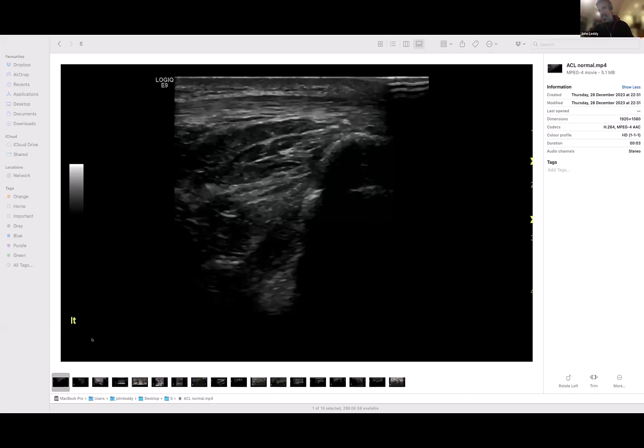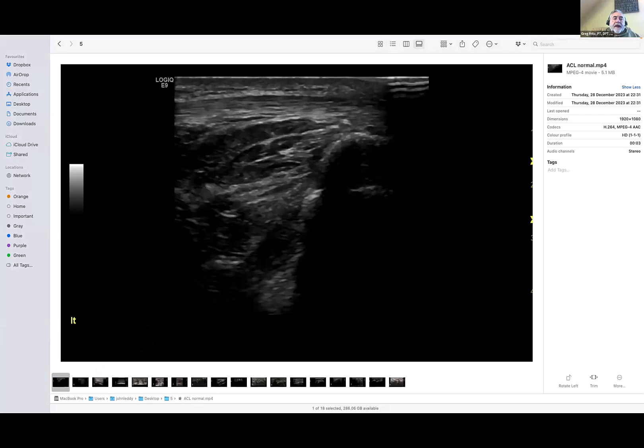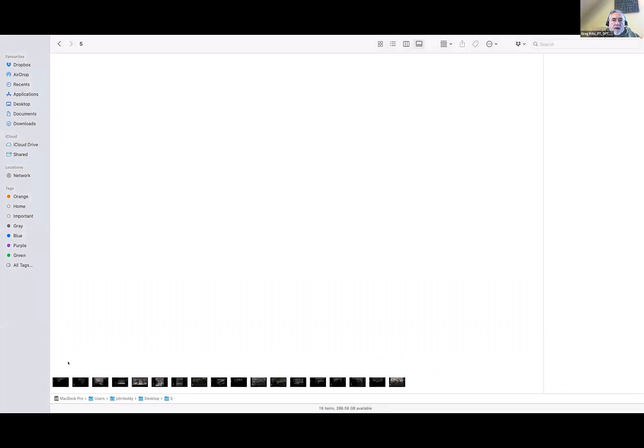This is a normal one. Under the collagen of the patellar tendon, there's a dark area — that would be Hoffa's fat pad. And the next hyperechoic or bright surface, that is the beginning of the joint capsule. But down at the bottom when we're oblique, that dark area is what you're referring to as the ACL.